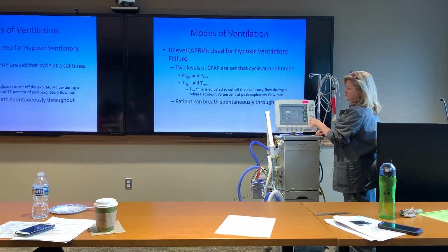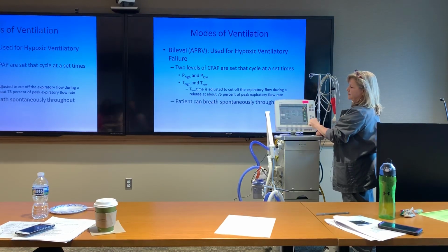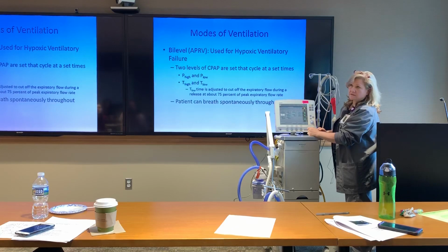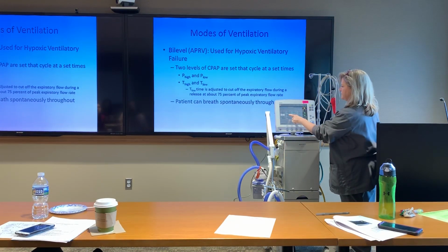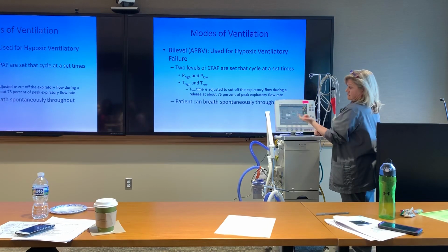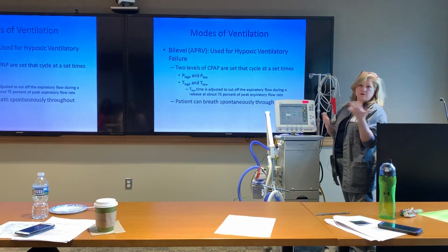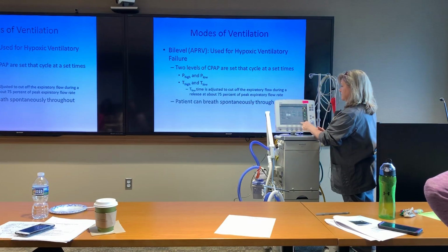Yeah, it's also known as APRV. If you ever want to really read anything about it, you want to search for the name Dr. Habashi from shock trauma. He's written everything there is to write about it, and he uses it all the time in shock trauma. They just put all their patients on APRV and Bivent. So kind of interesting.